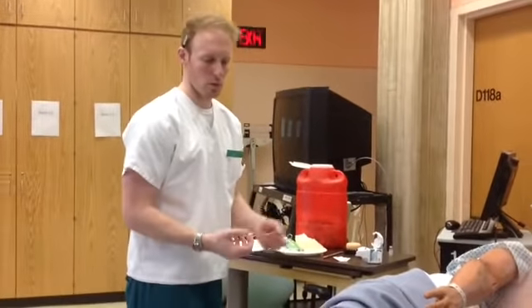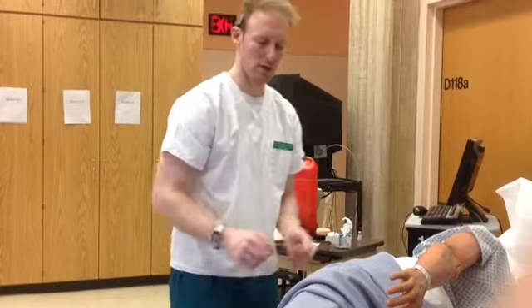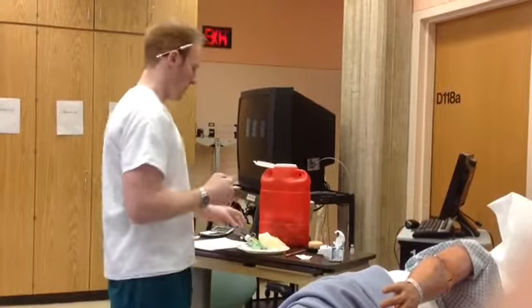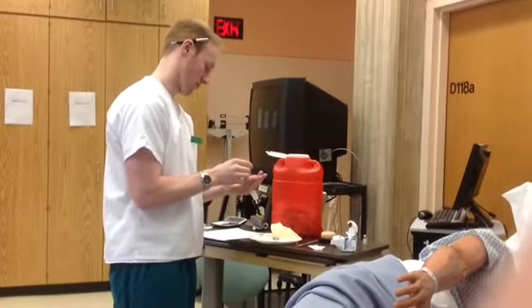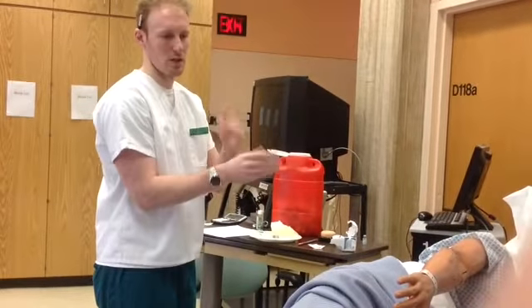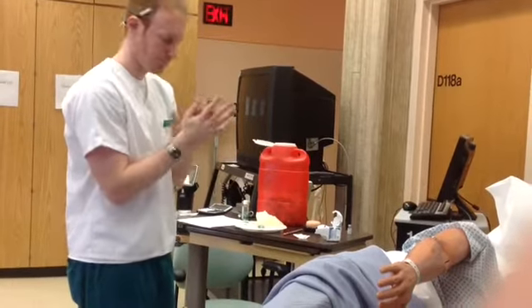Earlier, before I came into the room, he was assisted into this sideline position so that I'd be able to do the IM injection easier. Now I'm going to wash my hands. And just explain again that I'm going to give him this injection intramuscularly for infection, and he gets this every week for the next 6 months.